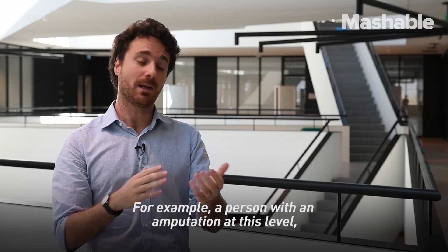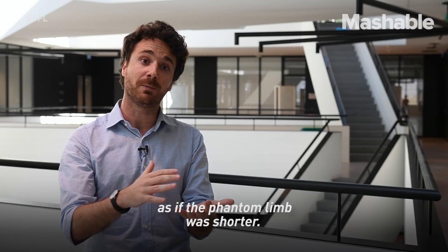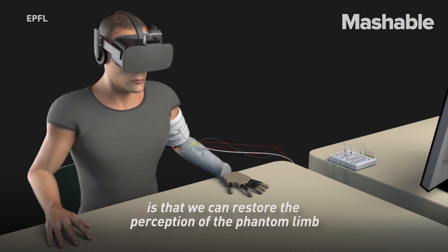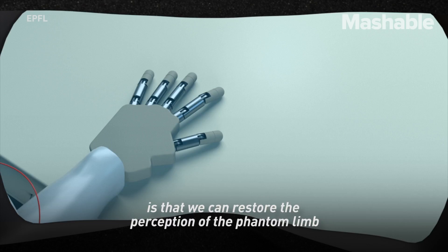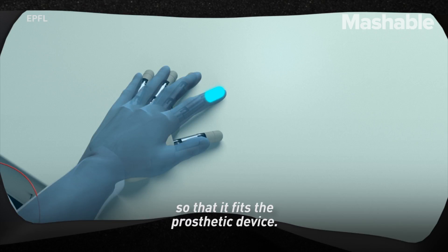For example, a person with an amputation at this level perceives his hands right at the tip of the stump, as if the phantom limb was shorter. What's really new about our approach is that we can restore the perception of the phantom limb and make it grow into the prosthetic device so that it fits the prosthetic device.